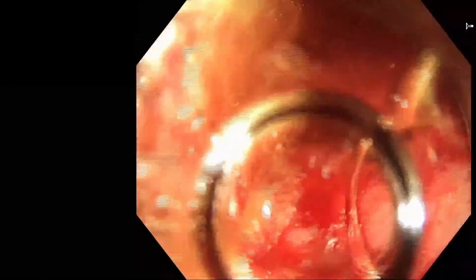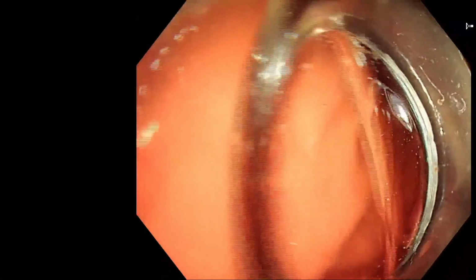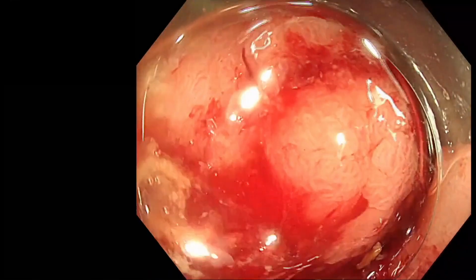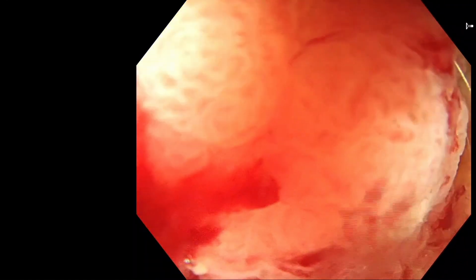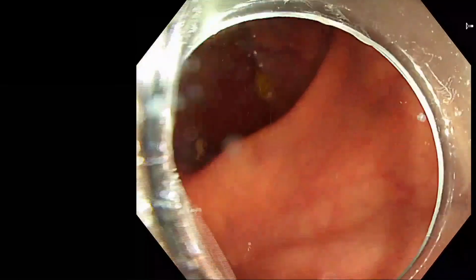And then there is this little depression. So my colleague standing with me, who just had a look at this before I did, mentioned that maybe there's a demarcation zone or a depression here. And I think she's right, but it's just behind the lip of the valve. And here we want to see whether that is indeed something for, is it because of invasion or is it just a depression? All right, so we'll get on and do that.